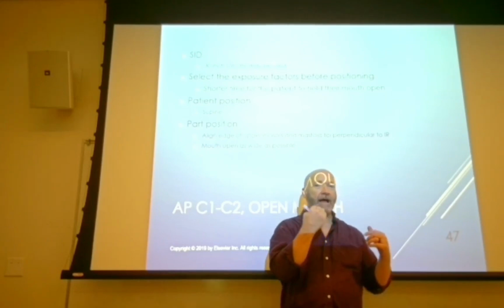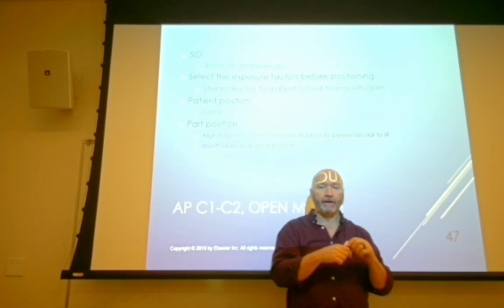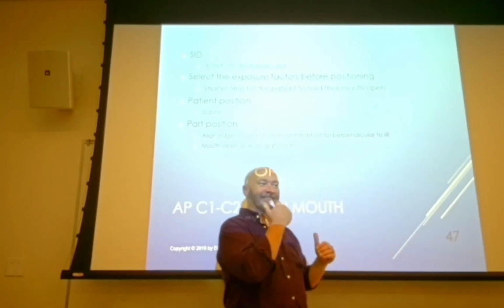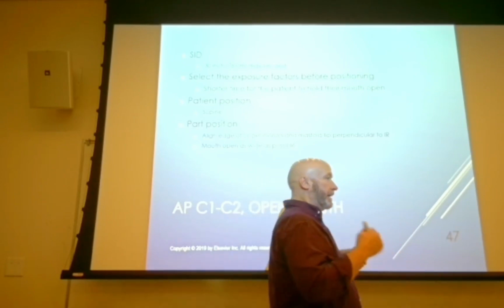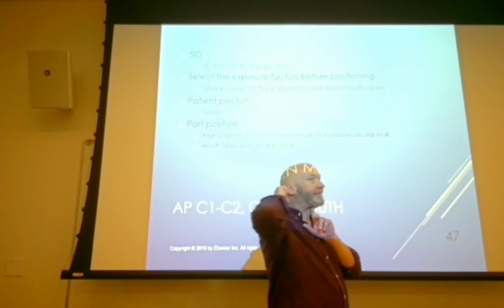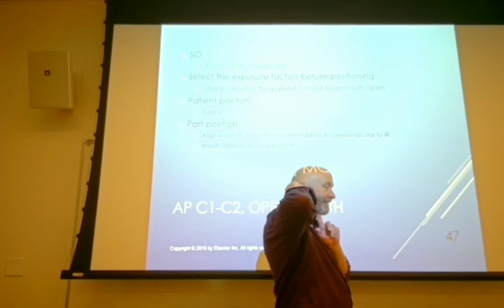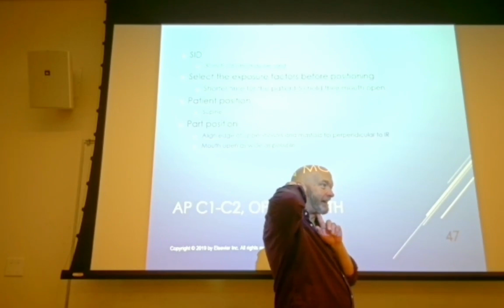You're going to center, after you get everything in position, to the center of the patient's open mouth. And what you're trying to accomplish, again, is to take the upper incisors, the teeth, and put them directly over the base of the skull. Now, base of my skull is right here. Okay? The odontoid process is right here. If I tuck my chin, then what's going to get in the way of me being able to see the odontoid process? Chin. Well, teeth, right?